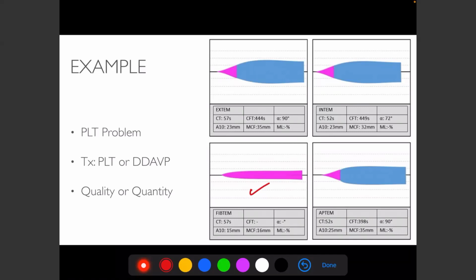So there are qualitative platelet assays that you can run on Rotem. Cooper doesn't have them, but they exist. I kind of ran out of time on stuff I wanted to talk about. So you can see which receptor is blocked, which is not blocked, et cetera. But this will tell you that it's either a number or a qualitative issue. And then you have your lab value for platelets. So say your platelets are 300, so it's not a quantitative issue. So that'll tell you that either they took an antiplatelet, they got an antiplatelet, et cetera.